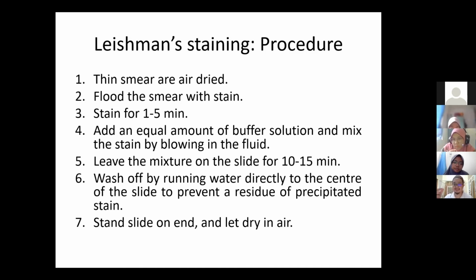Just a nice gentle smearing. As long as the whole area is covered and flooded a little bit, then stain for 1 to 5 minutes. Add an equal amount of buffer solution and mix the stain by blowing into the fluid. Again, blowing gently, not too hard. You just need a small blowing.